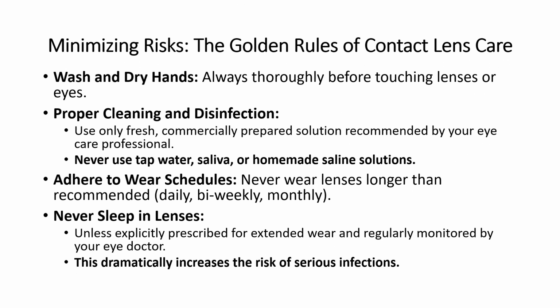To help ensure the safe enjoyment of your contact lenses, strict adherence to proper hygiene and wear schedules is absolutely paramount. Let's recap the golden rules. First, always thoroughly wash and dry your hands before touching your contact lenses or eyes. This is your first line of defense against harmful microorganisms.